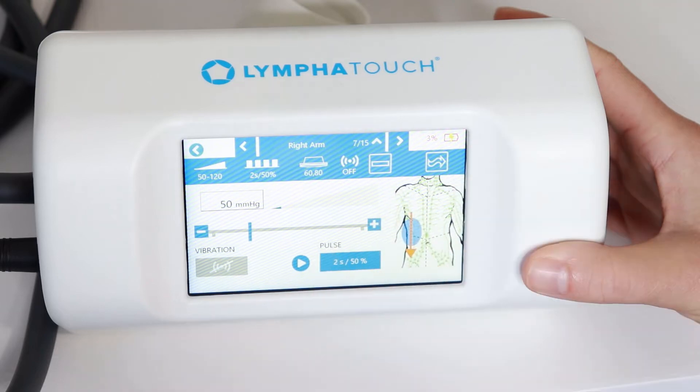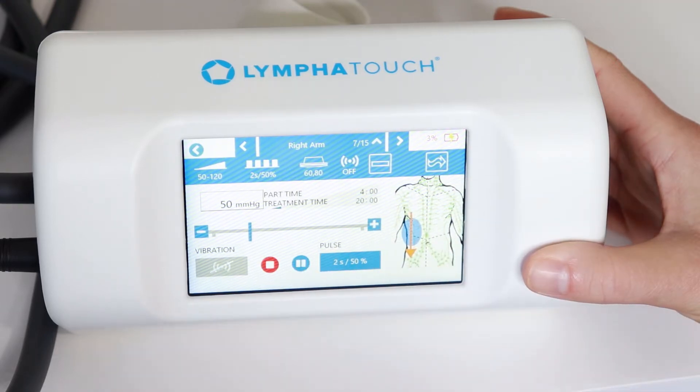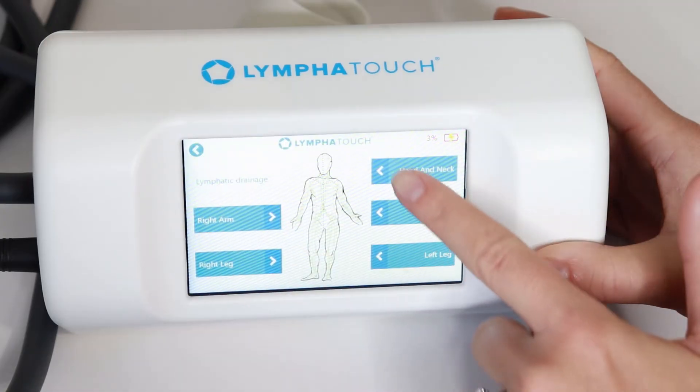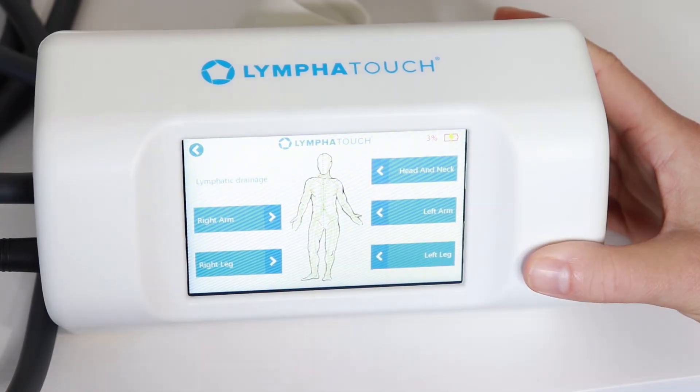The settings are already set for us — we just hit play and move along with it. It will time out for each section. Each area of the body has a short and long option, and they all walk you through the sequence step by step for lymphatic drainage specifically.